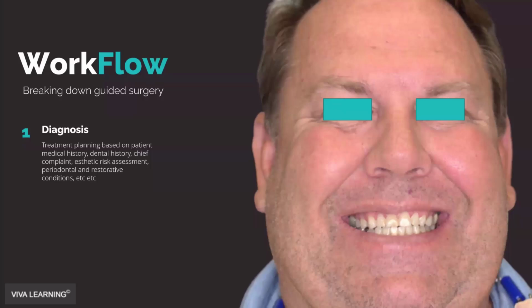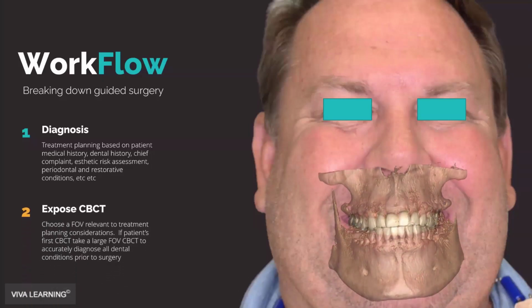So what's the general workflow for guided surgery? We'll just touch on that real quick. First, we're going to diagnose and treatment plan based on the patient's whole medical and dental history. Of course, we're not coming in just because they're missing one tooth. If we're going to take the CT, we need to read the entire CT. So we expose the CT with a relevant field of view.